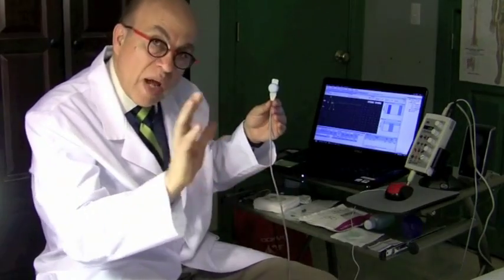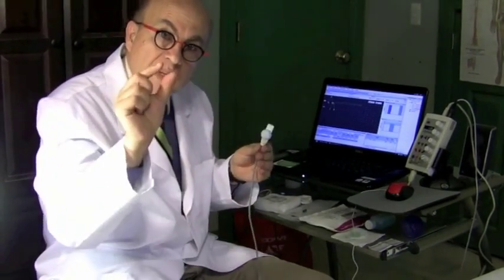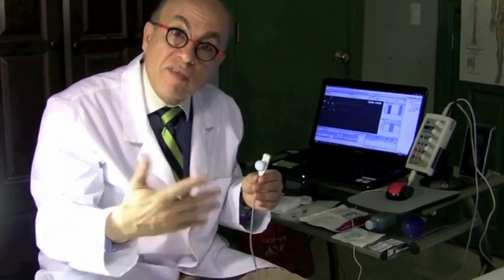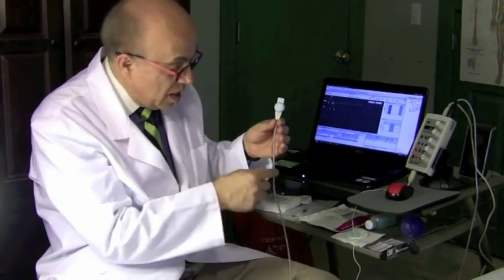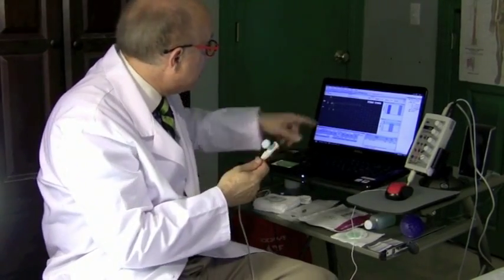So if I use the right kind of electricity and the right type of display of the signal, I'm going to see a very small wave, which is called the F wave, because it was discovered in the foot in the beginning. Then they found out it was present elsewhere, so it was still called F wave. So if I use the right stimulation tools and the right display of the screen, I'm going to see a very small wave that comes after the motor response that we have just seen, and that's going to be the F wave.